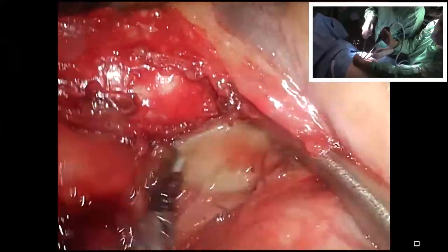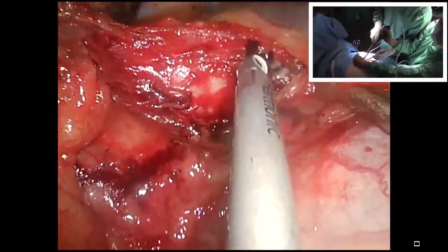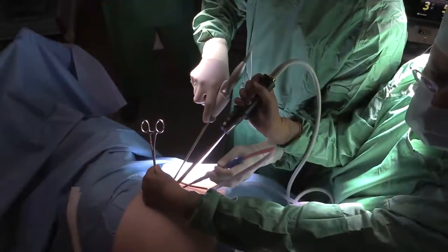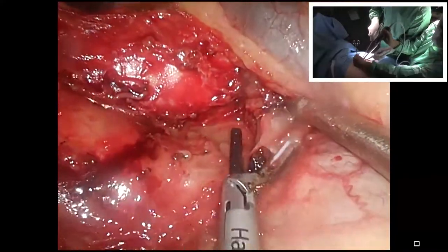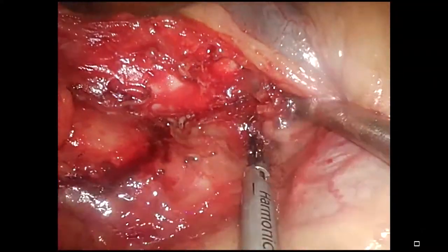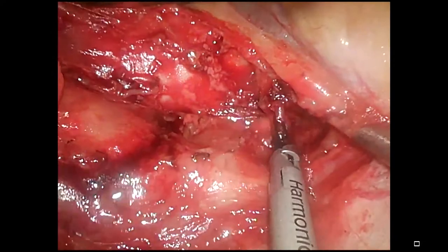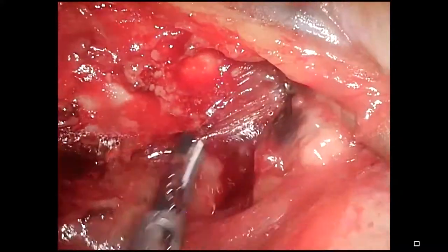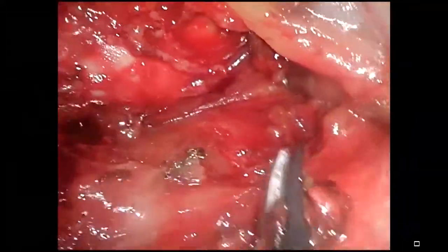So this is the step some of you would do later on, from above the azygos vein to take the whole specimen as a whole, station 2 to 4, right upper lobe. Therefore you in advance dissect this compartment, which has a little bit of fatty tissue there. But we see lymph nodes too, partially. It was uneventful in the PET CT.